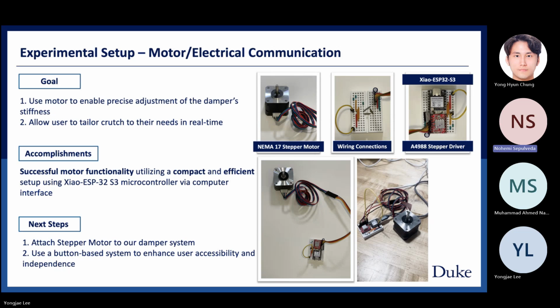We really think that having a simpler interface will help increase the accessibility and usability for the person using our crutch. It also plays into our goal of making sure that our crutch is very lightweight and overall is just a very ergonomic design.